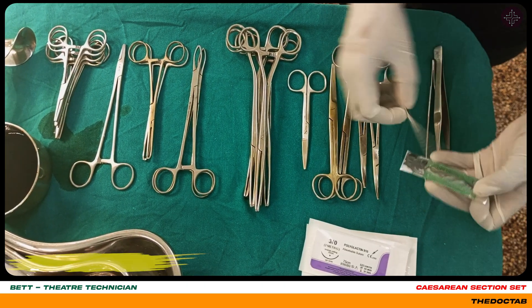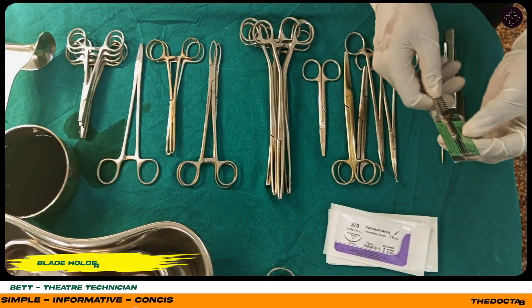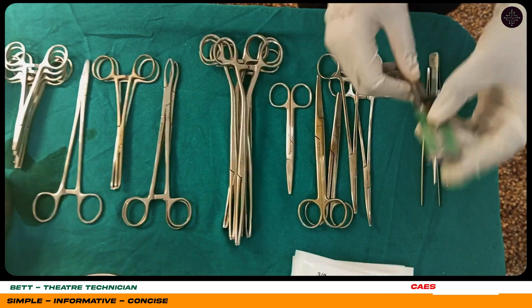Here we have a blade holder, as you can see. It's basically used for holding the blade into place while making incisions.